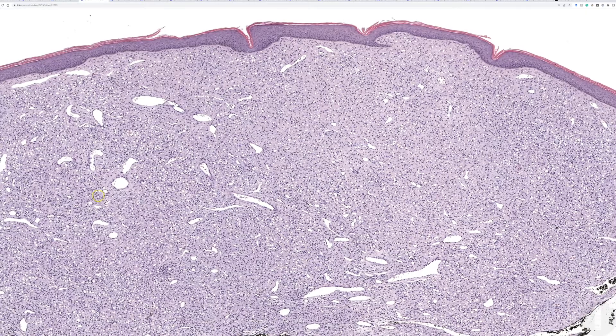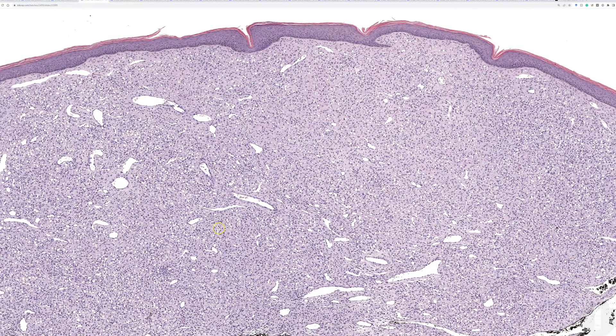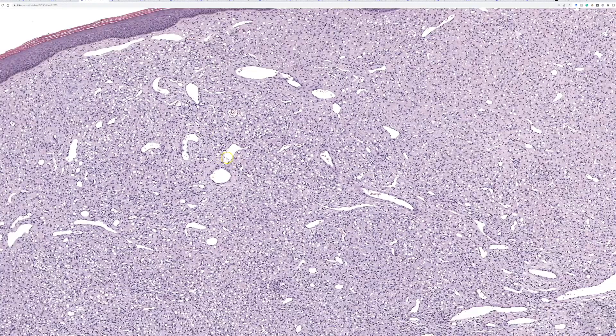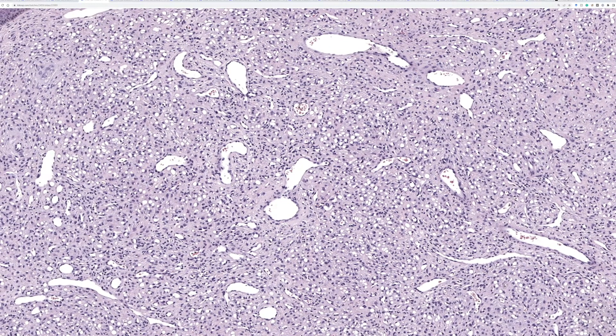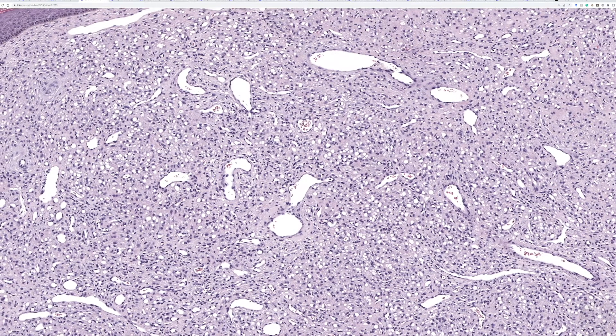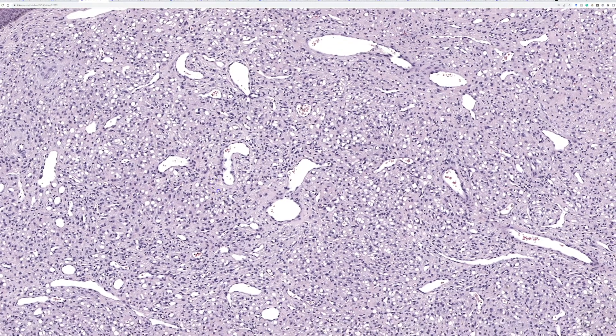The cells form a diffuse sheet, and there are dilated, almost staghorn hemangiopericytic pattern vessels, like the pattern that we see in solitary fibrous tumor.